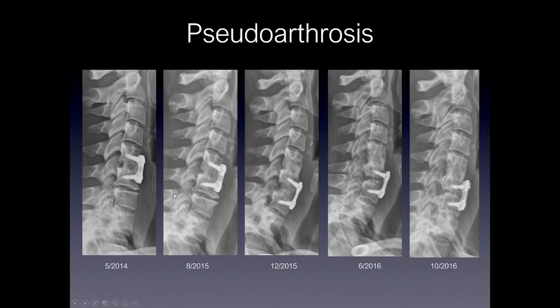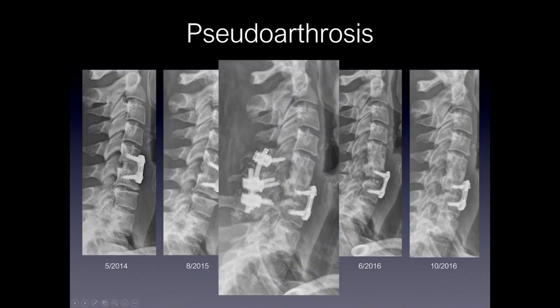Here's another example of pseudoarthrosis. This patient was operated on in May 2014 with a single-level ACDF. By August 2014, you can see lucency along the margins of the interbody plug. There is then a slow breakdown with lucency forming around the actual vertebral body screws, some settling of the spine, and eventually significant lucency and collapse of the actual graft and construct. Finally, the patient required posterior fusion to stabilize this level of instability.